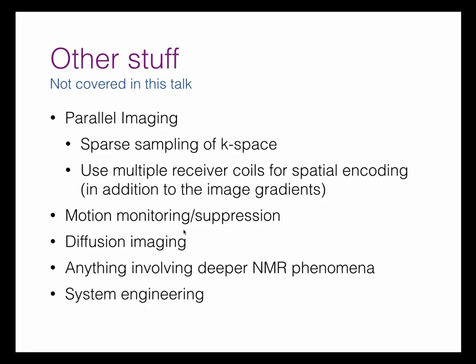So for a head, a lot of the time you're dealing with kind of rigid body motion. You can model it as a rigid body, and that works reasonably well for a lot of things, but not for everything. If it's gross motion and you can model it as a rigid body, the easiest thing to do is to suppress it by padding the subject in really well, but everybody knows that, right?